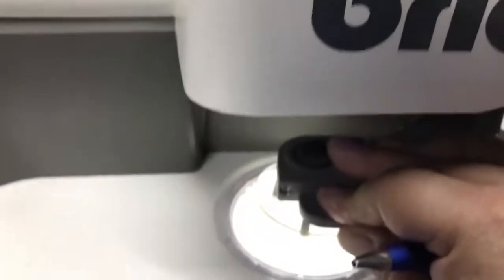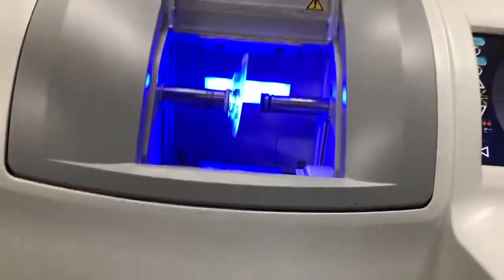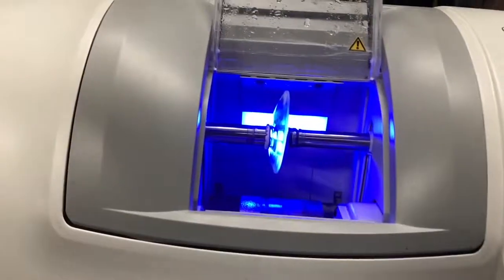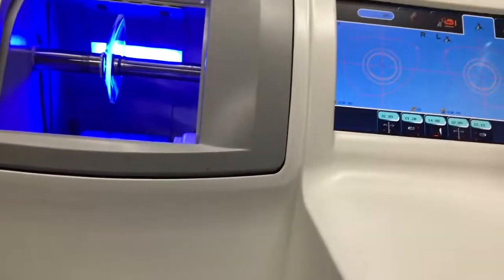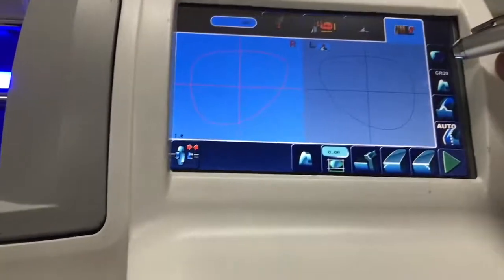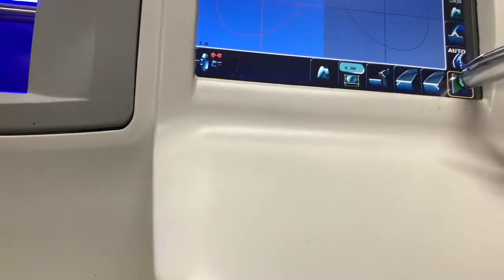It's centered and ready for blocking. We already placed the pad and we just block it by hand — it's PD manual — and it works beautifully. Place the lens inside and close the chuck. We go back to the menu. It already shows CR-39 lens and it's ready to go. Close the visor.